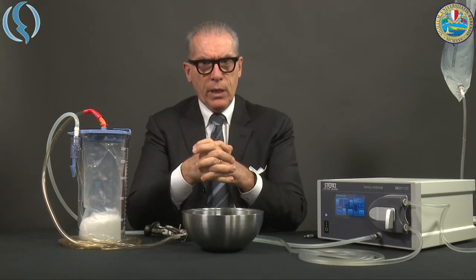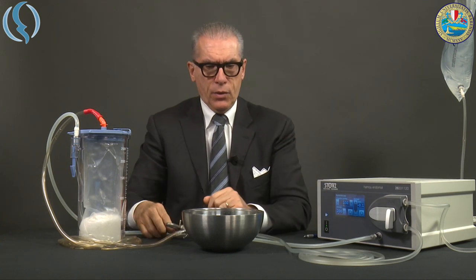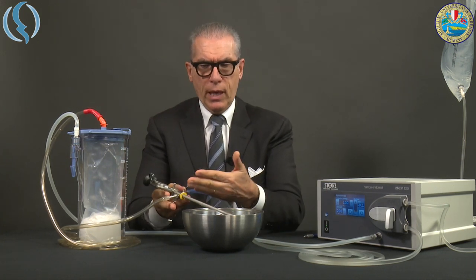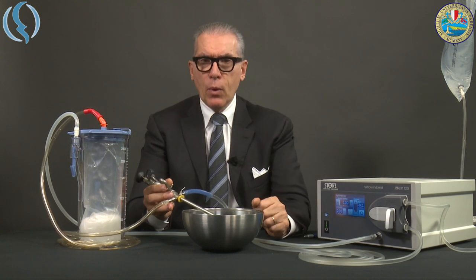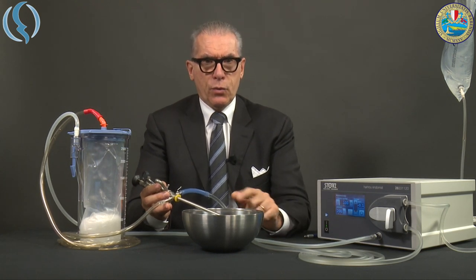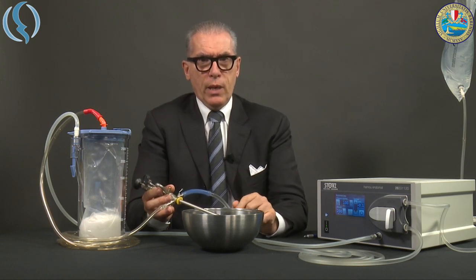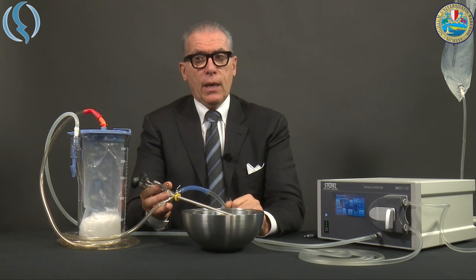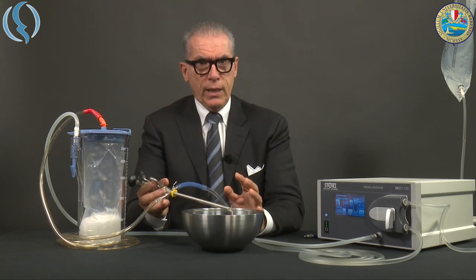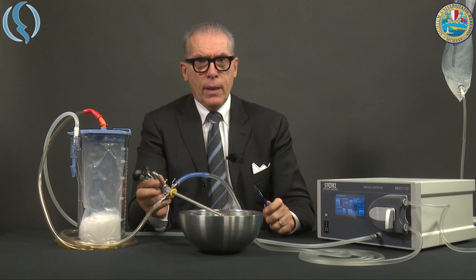Once everything is connected, we start the pump, which works almost similarly to the previous one. We have the resectoscope with inflow and outflow connected. We start the flow first and wait until all the bubbles are eliminated from the circuit — this is important because if bubbles enter the cavity, it will be almost impossible to remove them due to the different surface tension relative to the scope itself.